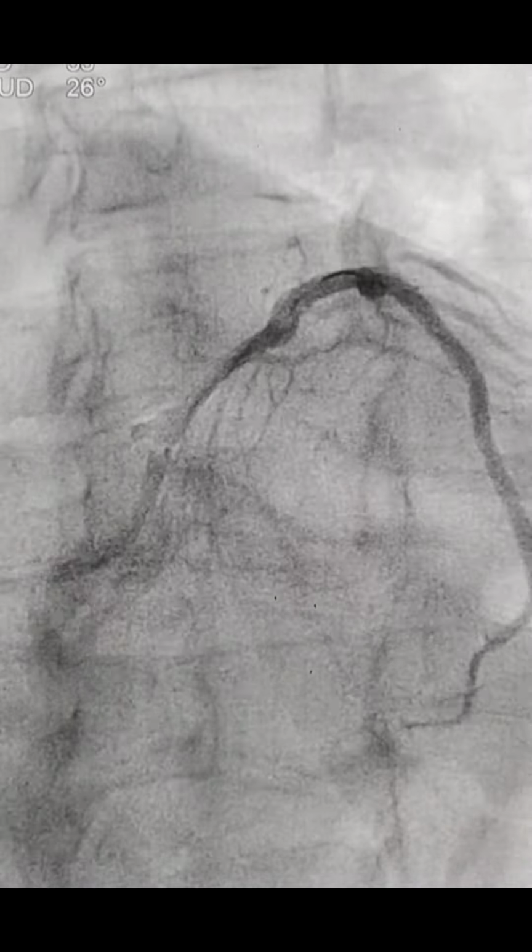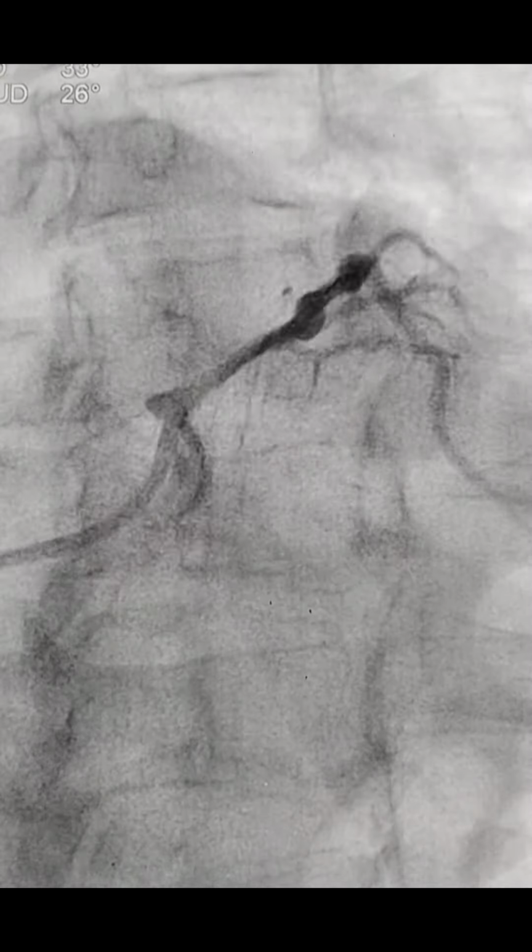Then from the IVUS understanding we took a stent of 3.5 by 28, and we wanted to deploy it from the ostium because there was a lesion in the ostium also, ostial LAD. This is a difficult coronary anomaly, and right from below the origin of LAD there was an LCX origin. So we wanted to save LCX also. So we took a stent, and we started to deploy it from the ostium of the LAD, and we planned to flare it in the aorta.